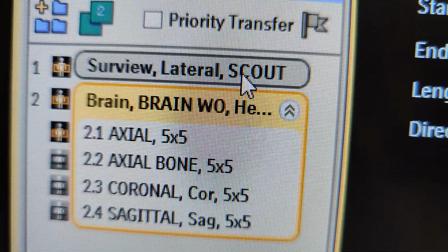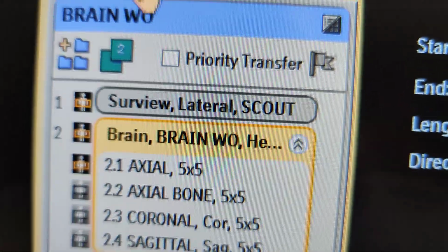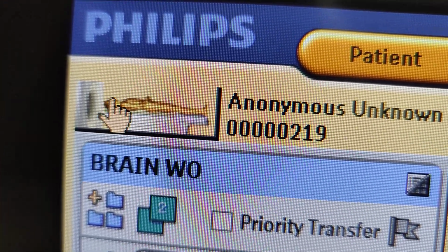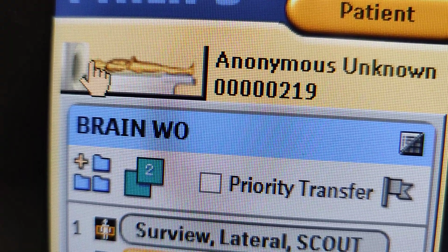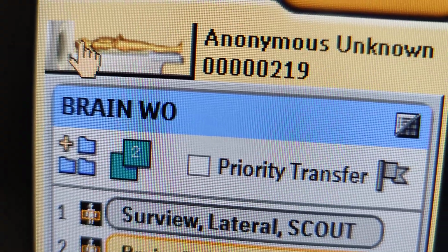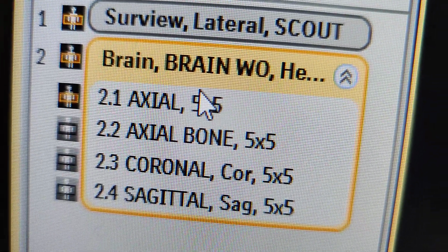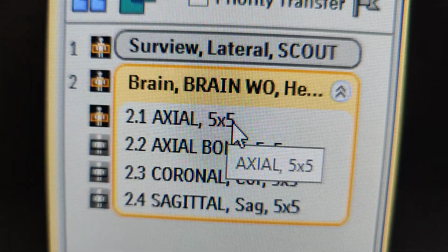Then for the sagittal line, if the person is facing you, the top light is going to hit their nose, the midsagittal line, between their eyebrows, their nose, and their mouth. You want them isocentered with the chin down, so the orbits are out of the way and you don't have to tilt much.